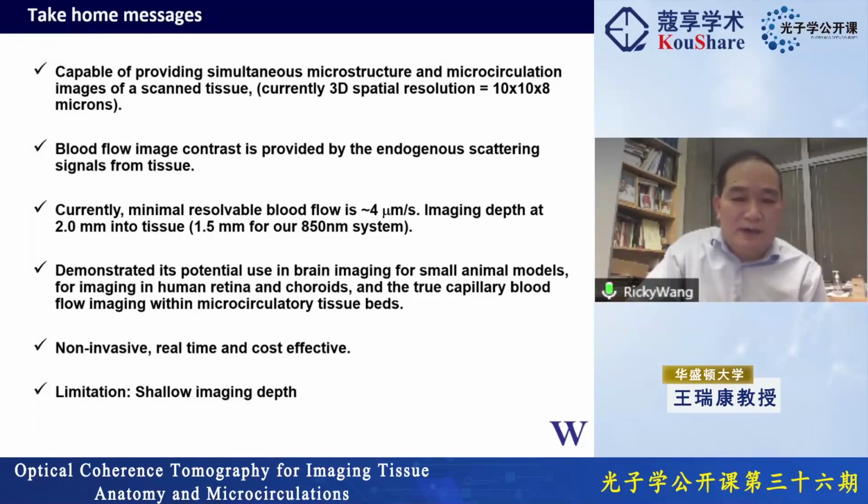And nothing is perfect. OCT has a huge limitation: it is a shallow imaging technique. The maximum depth into the tissue is about 2 millimeters. If you want to look at skin tissue, the maximum depth is about 1.5 millimeters. So this is a huge limitation for OCT.